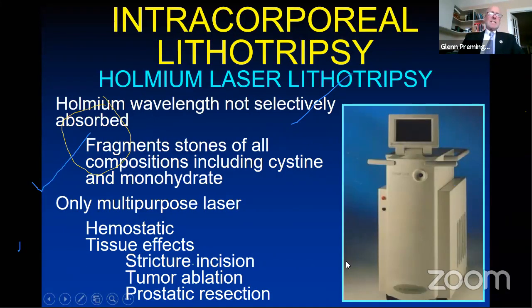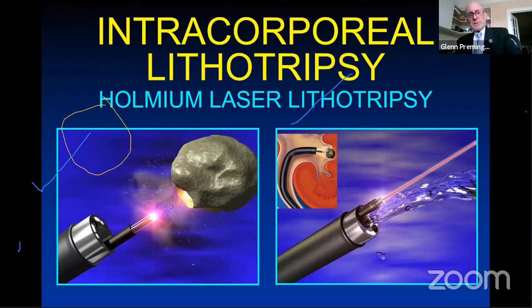So beside the digital flexible ureteroscope and the ureteral access sheath, we also believe that the holmium laser has had a major impact in our ability to successfully remove stones in the ureter. The holmium laser has a wavelength that's not selectively absorbed, and it fragments stones of all compositions. In addition, it's the only multi-purpose laser that has both stone, hemostatic, and tissue effects. So the holmium laser is flexible, and it will fragment stones of any composition.